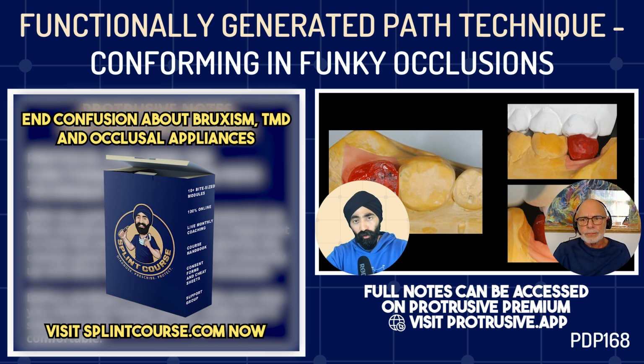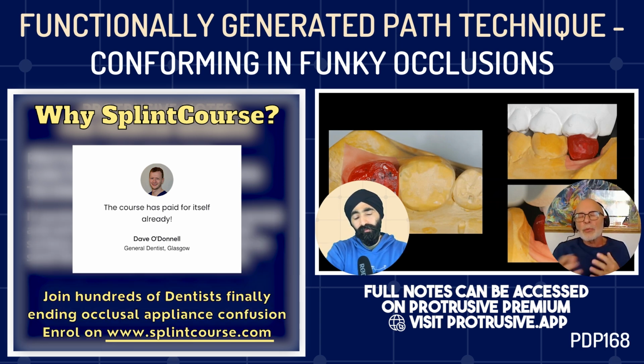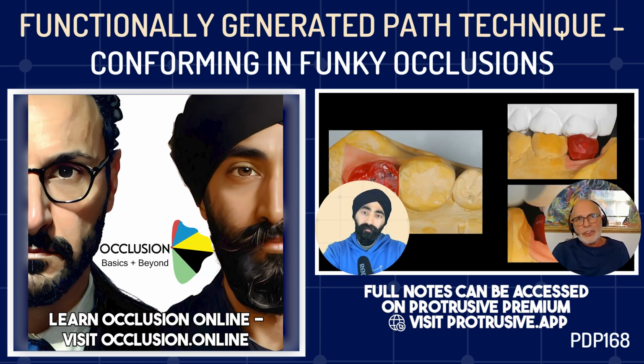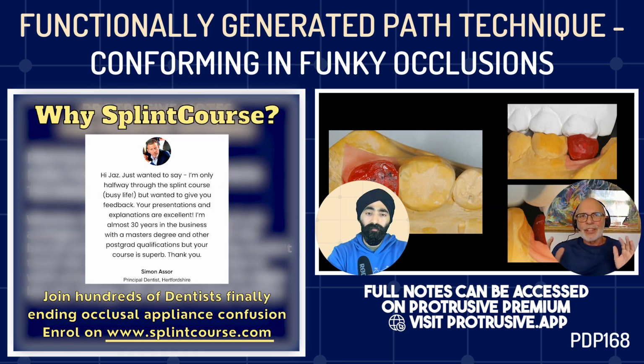Could you then check this on the model as well to make sure it sits nicely, or is that usually not possible? Yeah, if you're working digitally, you can now scan that little hat that you've generated and send it. That's your occlusal surface, and you can send it to your technician. If you're working in analog, you obviously have to send the abutment back and the hat back. Whether they're working in analog or digital, they have to do the buccal and lingual contours.